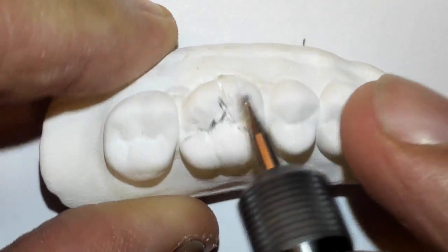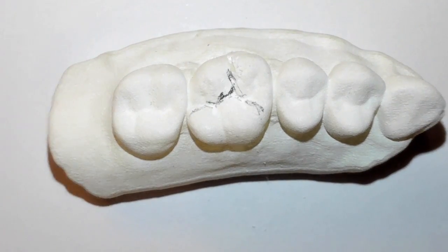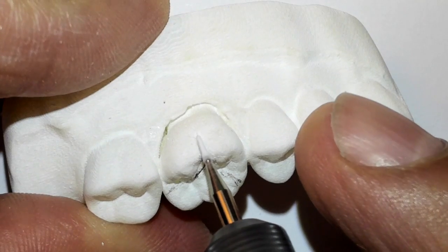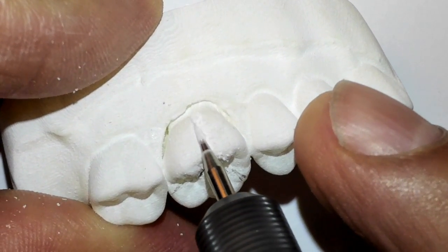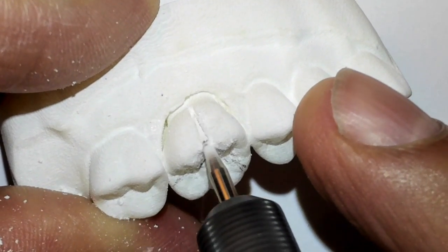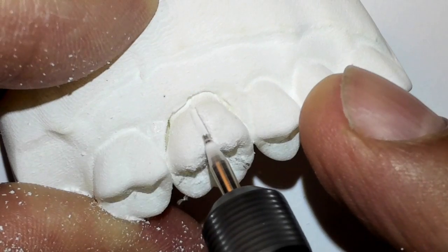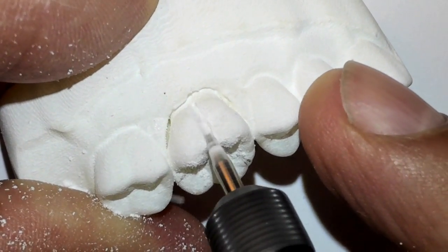I'm going to change burs and actually increase the speed a little bit. I'm going to bring the fan a little closer. Doing my straight cut straight in. You can do this too at home with a fan on. First time doing it with a printed model, so bear with me here.